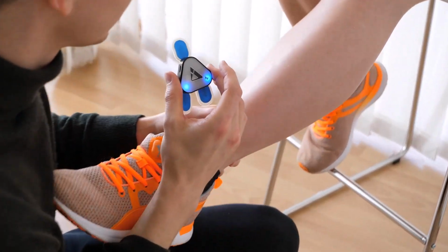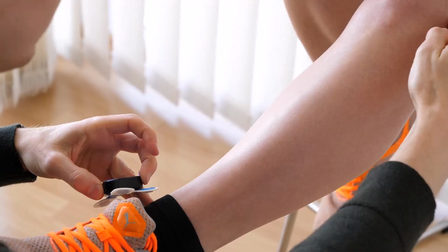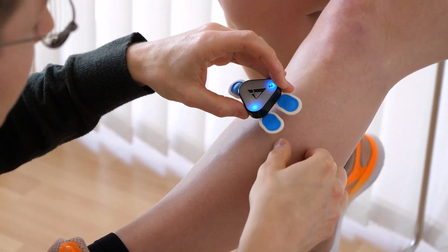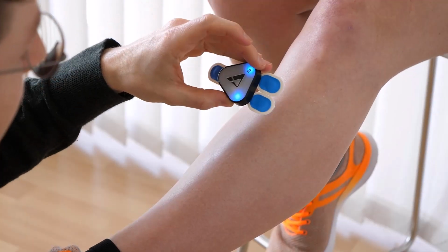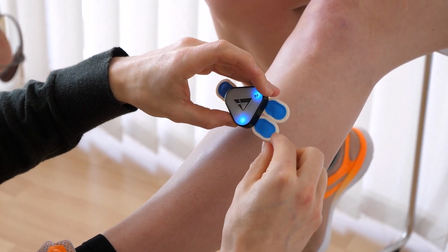Then we measure out the distances of 2/3 and 1/3 already discussed, go into the muscle belly and observe the muscle fiber direction for the application of the electrodes. It is important that the electrodes are close together. This guarantees a distance of 2 cm, which is the standard in surface EMG procedures.